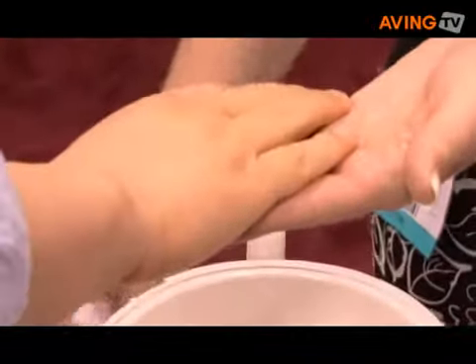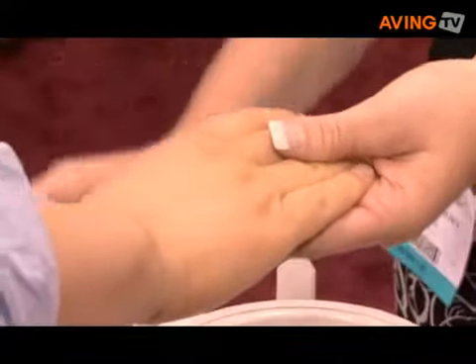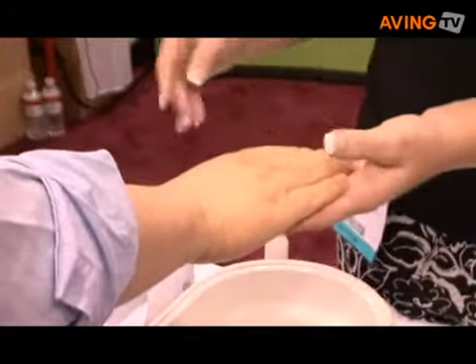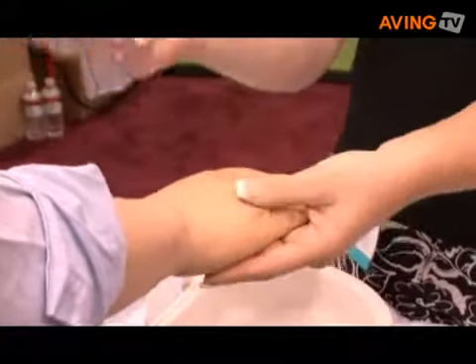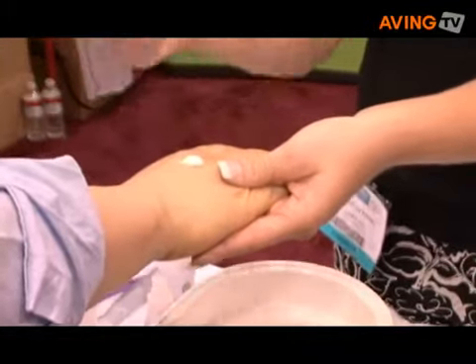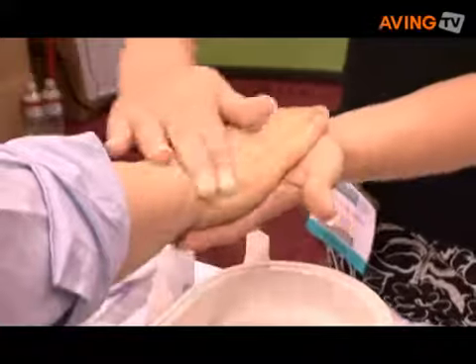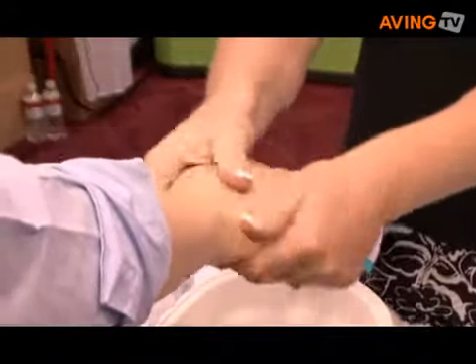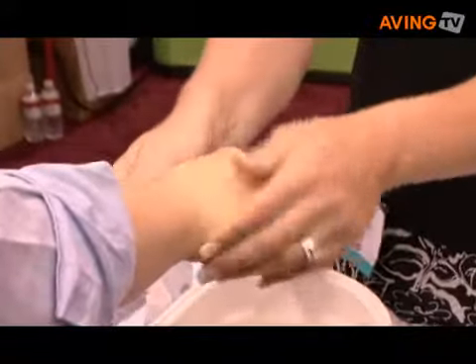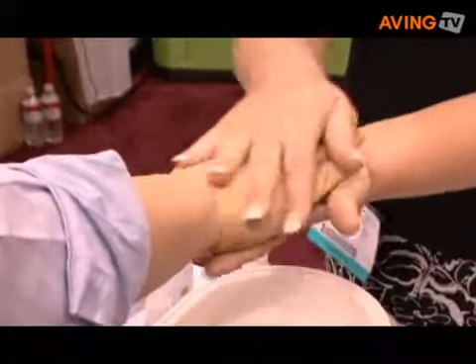What I first put on here is a sanitizing spray. You want to follow best practices and make sure the hand is clean before we actually do the paraffin dip. I'm going to follow that up with a hydrating cream. You don't have to do this step, but it adds a nice bit of hydration to the skin in addition to what you'll get from the paraffin itself. If you have a favorite anti-aging product, or any gels or creams that you like, you can use those as well.